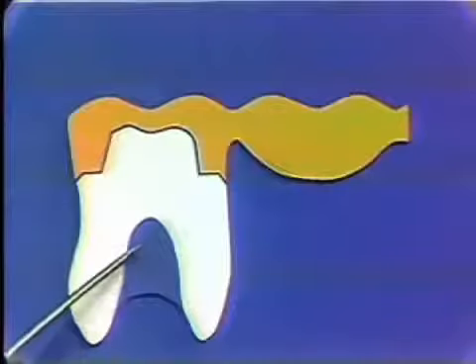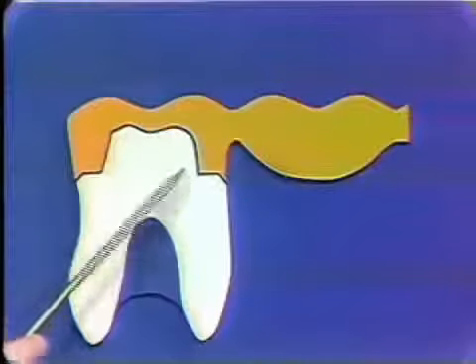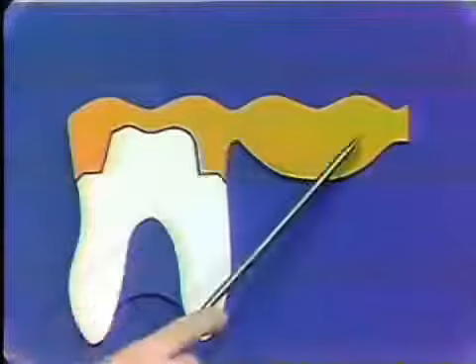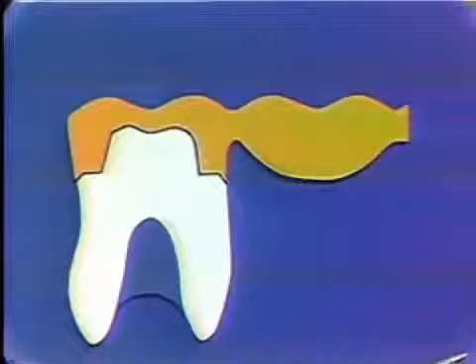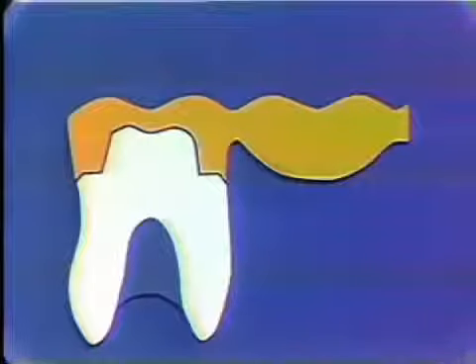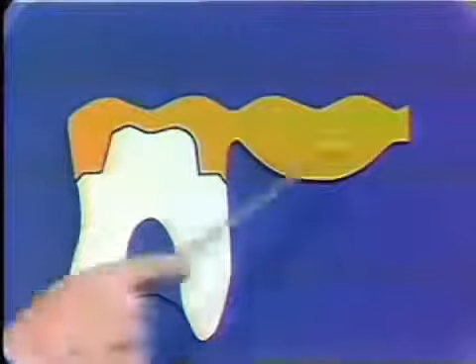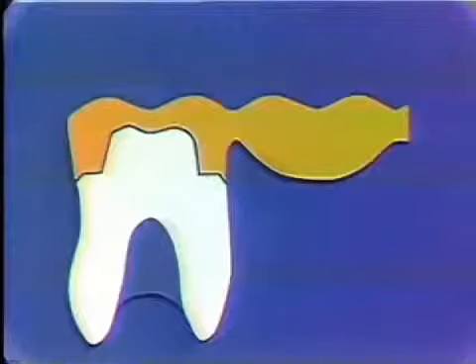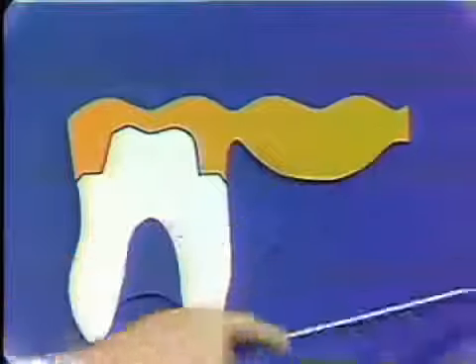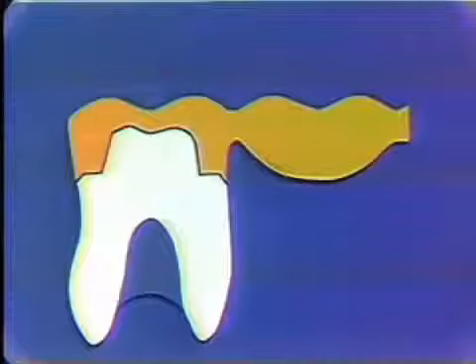This is the mandibular molar that we were looking at, in which a bridge retainer preparation has been cut here. And this represents the bridge running along here to another retainer on the bicuspid here, which for simplicity is not shown in this diagram. Now that these two teeth are linked together by the bridge across here, the whole thing has to accept stress and respond to it as a unit. And any weak link within this structure here is liable to fracture and to dislodge the bridge.